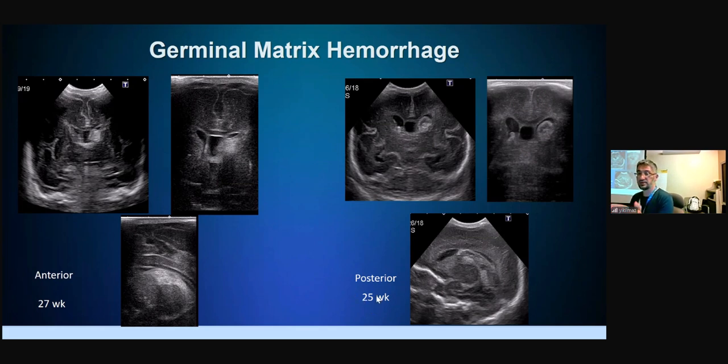So in this paper, they claim that even if this looks very posterior and large, it can still be grade 1. This is completely a different approach than the classification system we know. But this is a new study. I just wanted to mention this.